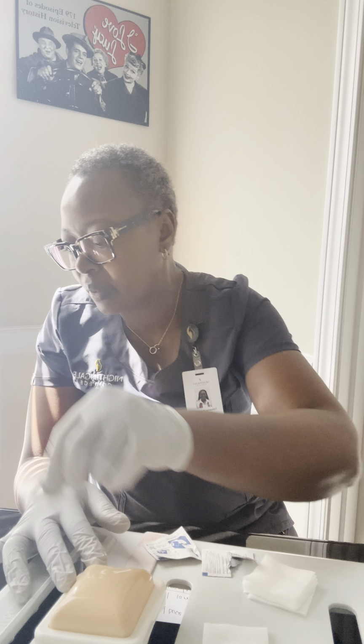Then I'll go ahead and clean the area, marking the anatomical site where I'll be doing my injection. I'll be careful not to introduce new dirt on the clean area, and I'll wait for it to dry without touching it.